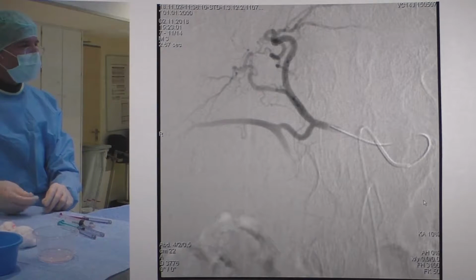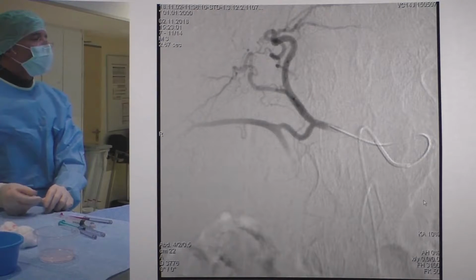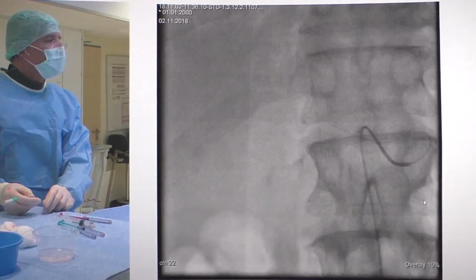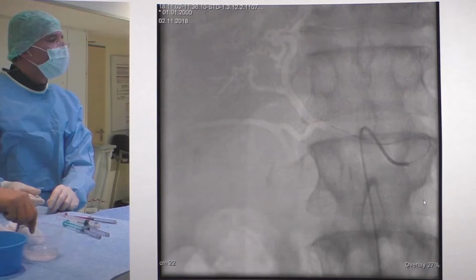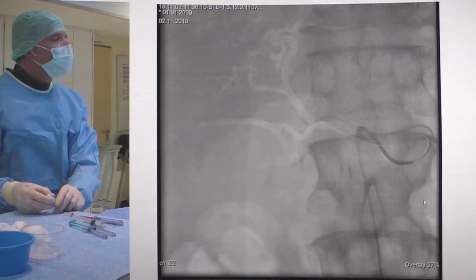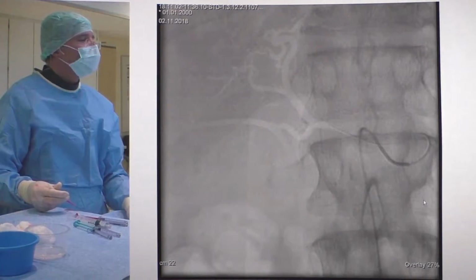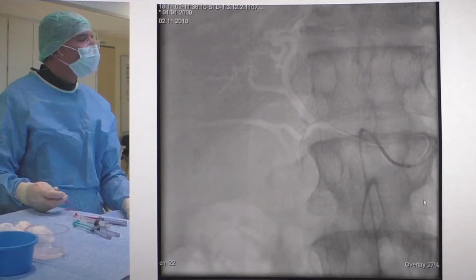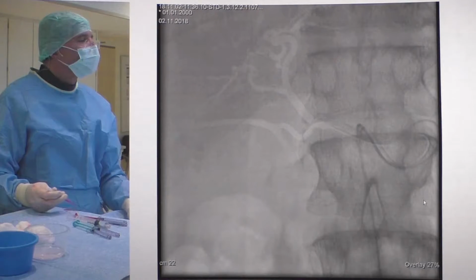The saved images can be used in an overlay and can be superimposed onto the X-ray image. And the catheter will hopefully move in the right direction. It's a little bit more difficult than I thought because the vessels are very tortuous and there is a lot of pretension.